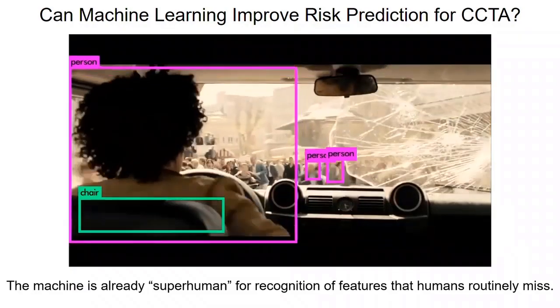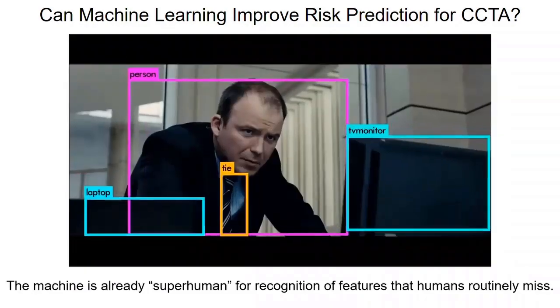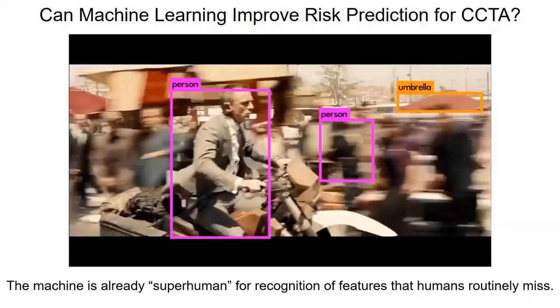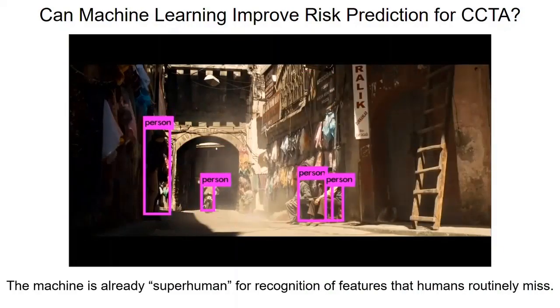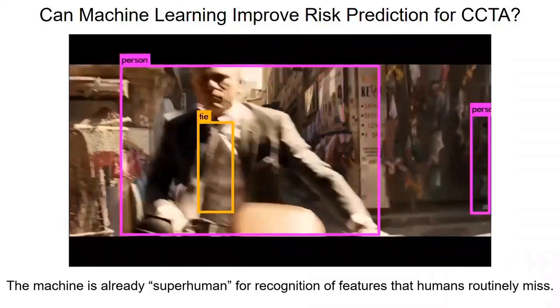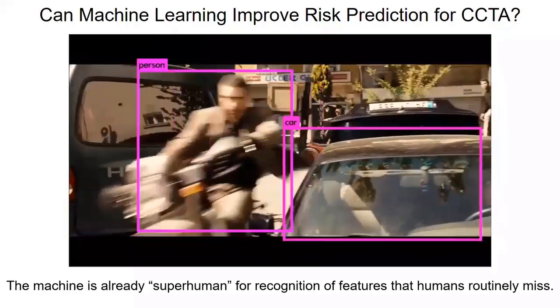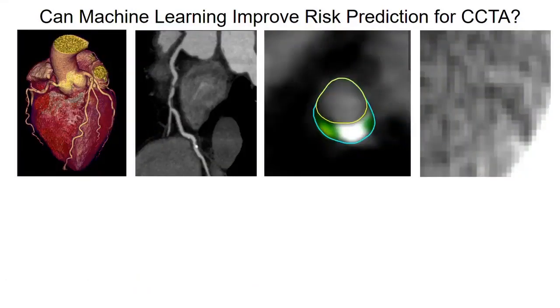So I think what you're going to see are a tremendous number of quote-unquote innovations where they apply machine learning to either lung nodule detection on a CT scan or a hemorrhage on a brain MRI or something like that, and that will be the first foray of where we see machine learning applied to CT. And when you look at a CT scan and you start to break it down from a macroscopic all the way down to a microscopic view, we can look at these volume rendered views, and then we can do MPRs and look at the coronaries.